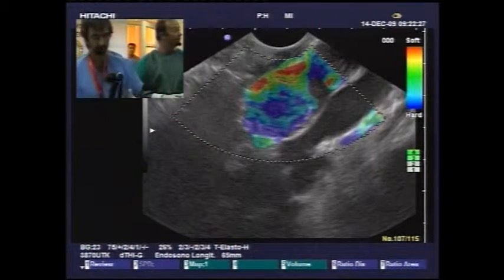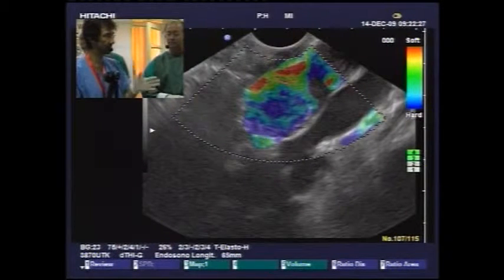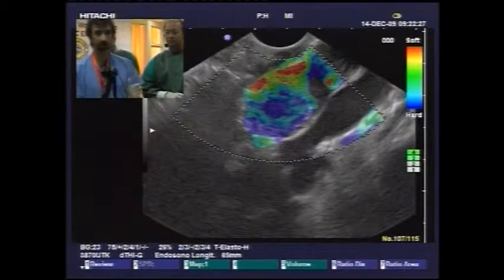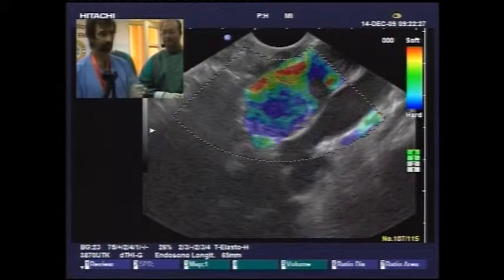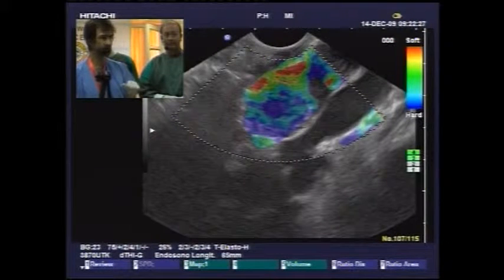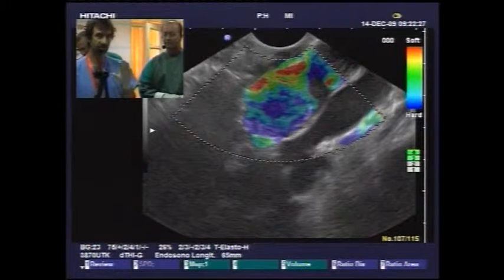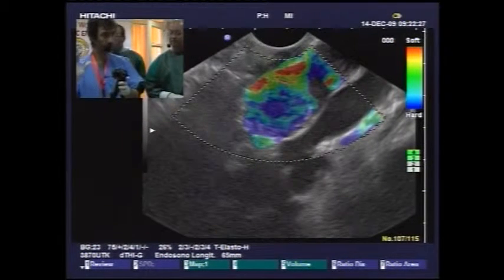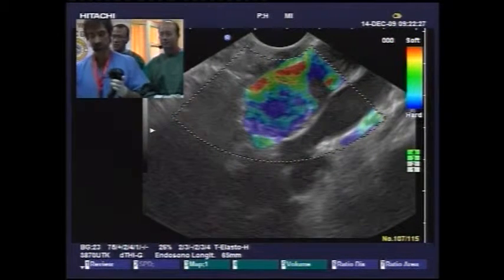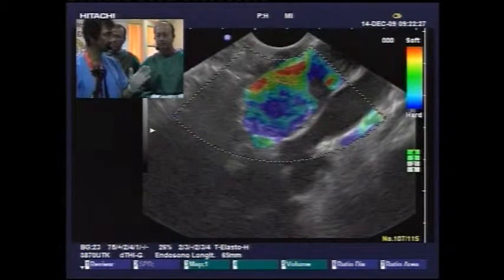In my experience, I unfortunately have not such a big experience in TB, because in Italy and in Europe TB is not so frequent. I've been abroad working several times, and in my experience, all the times that I had to perform a biopsy in a lymph node, typical lymph node for TB has a pattern like this. Sometimes, in particular when the lymph nodes are so big, the pattern is very typical. Sarcoidosis, I agree with you, because inflammatory lymph node and sarcoidotic lymph node are very similar.